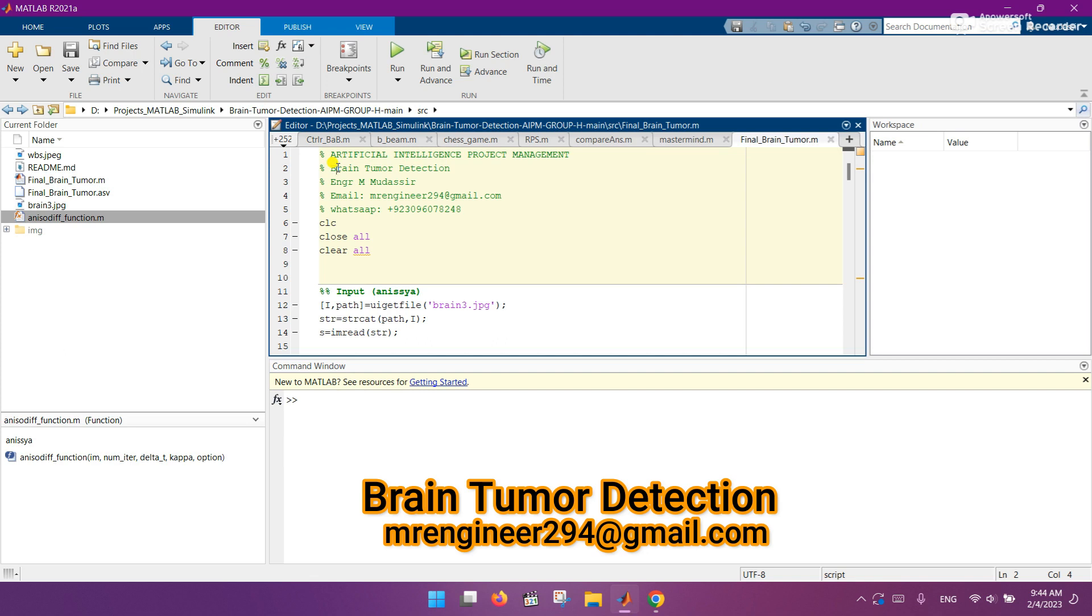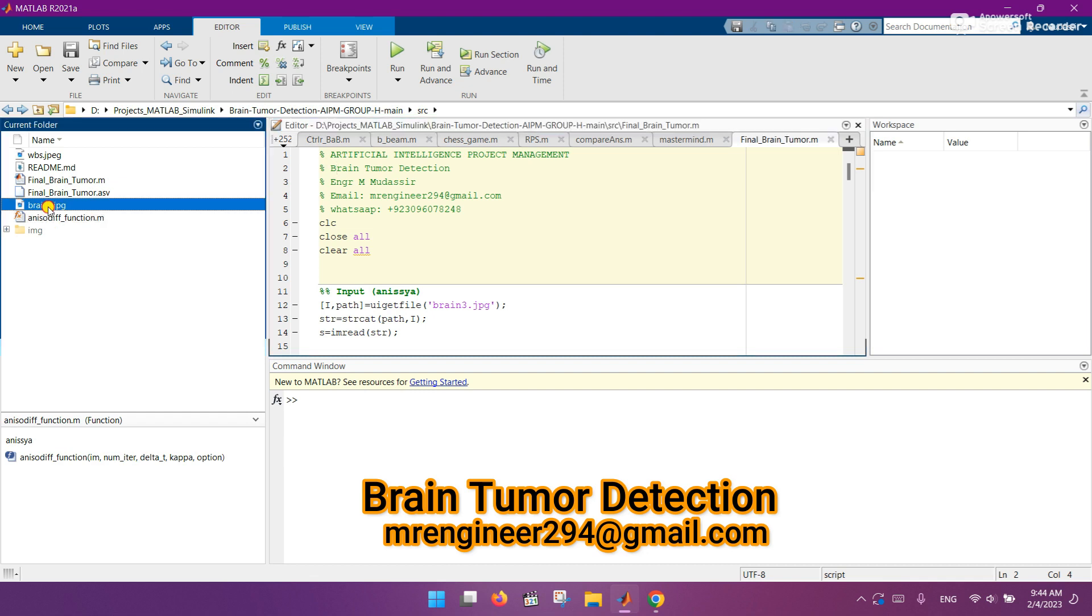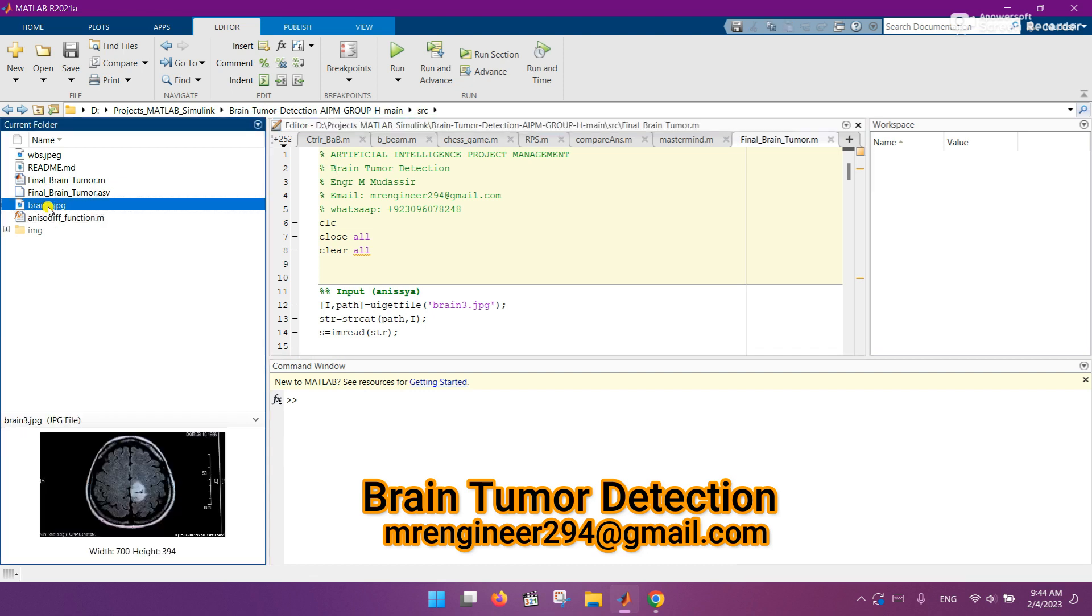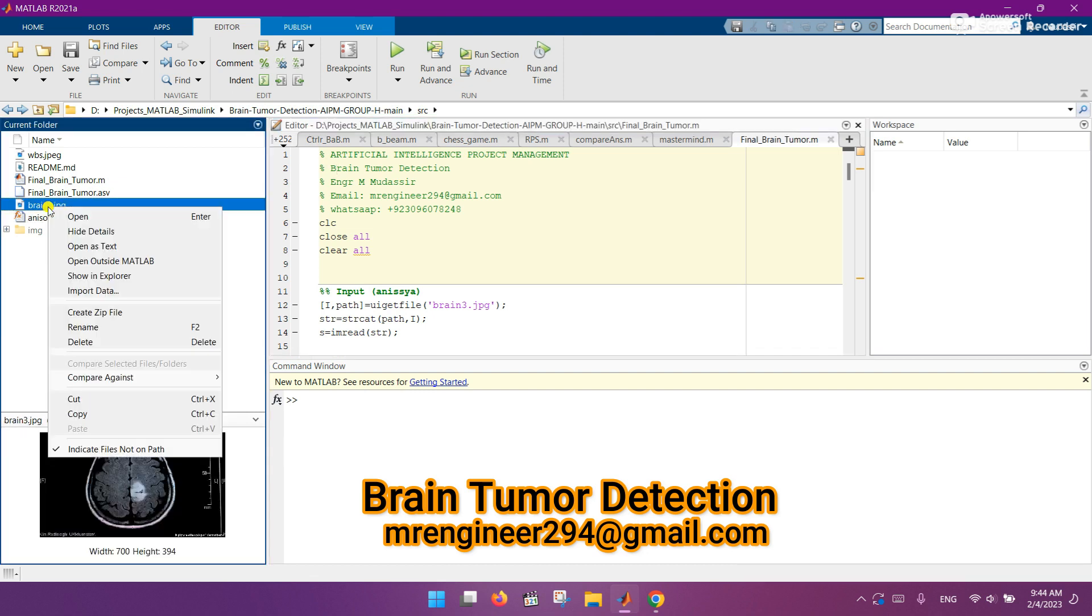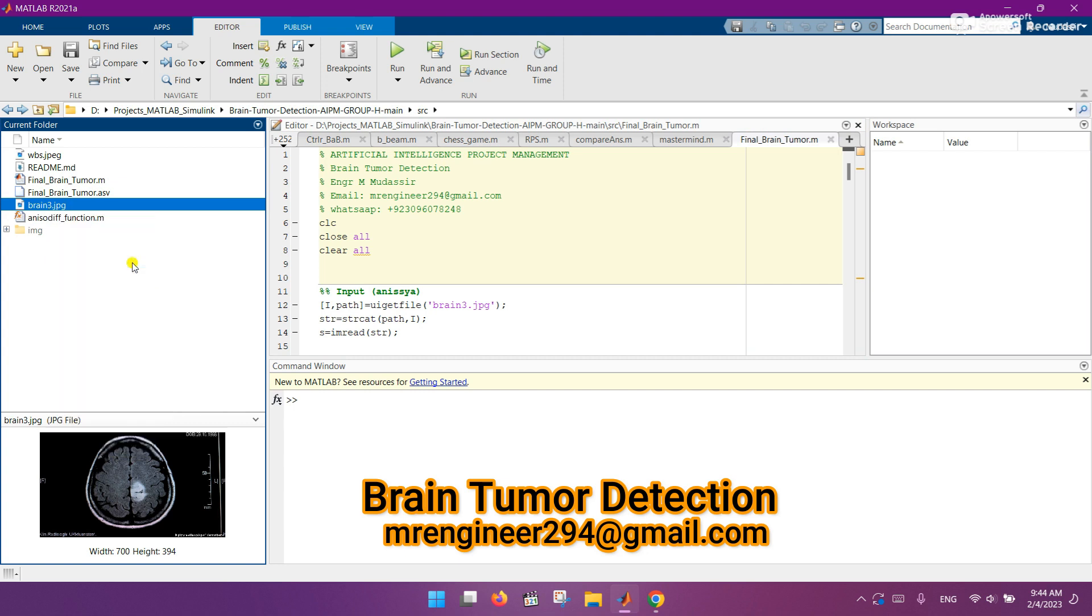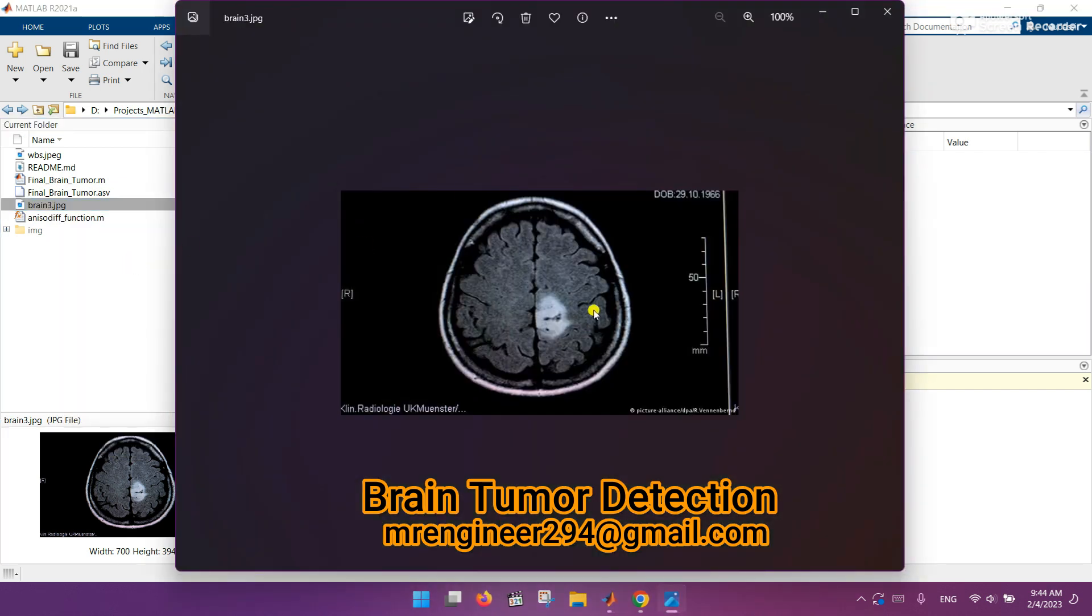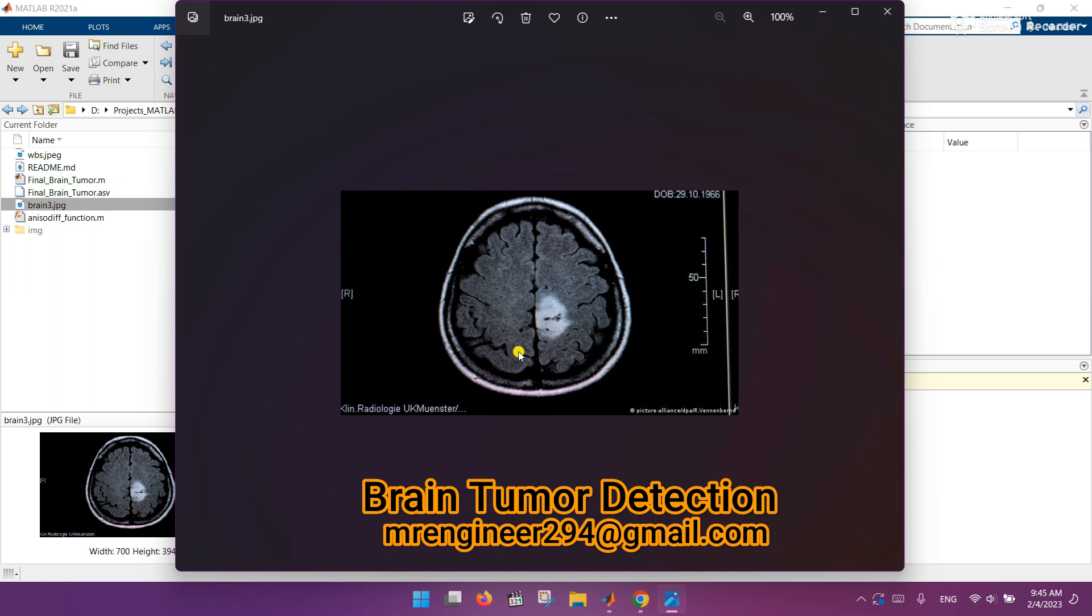So let's see the results. First of all, I want to show you the input image which I am using for analysis. Let it open. Here is the input image of our brain, which I got randomly from the internet, and I will put analysis on it to detect if this image has a brain tumor or not.